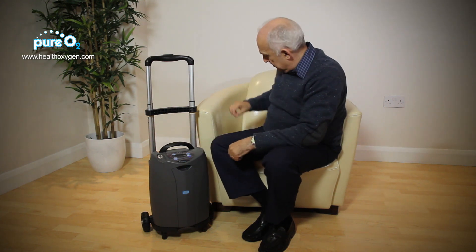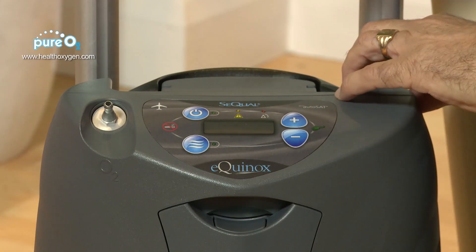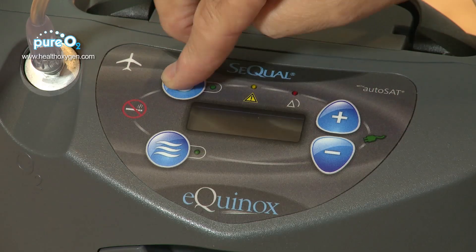It's easy to use. You take the nasal cannula, put it over the ears, take the end of the cannula, and put it onto the machine. To start the machine, you hold down the on button.